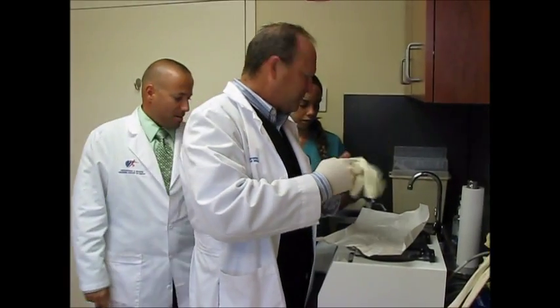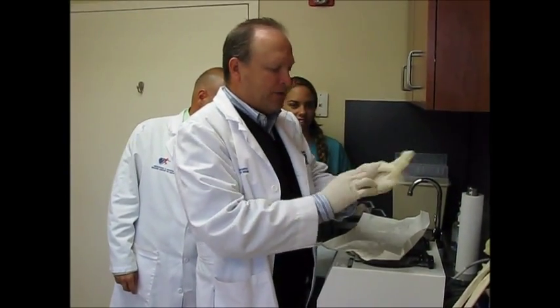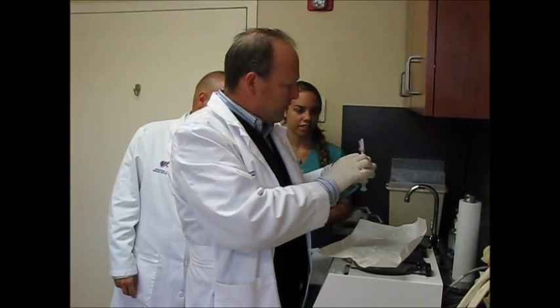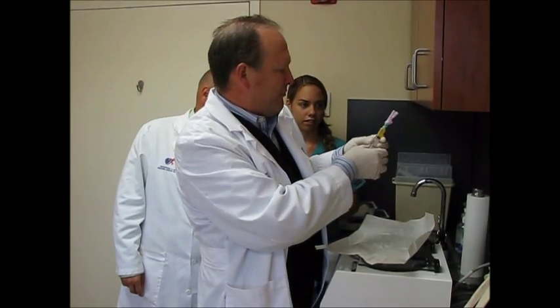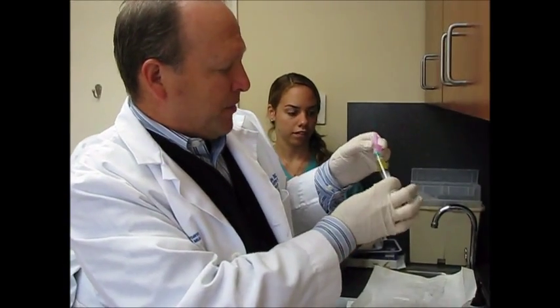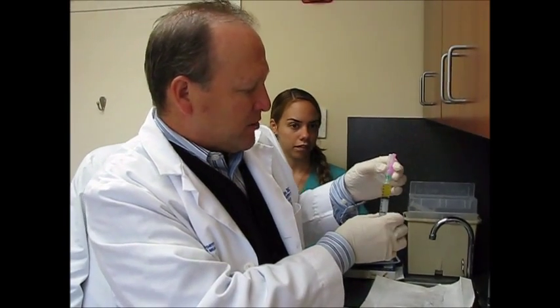We're doing this under sterile technique — sterile gloves, all sterile products. That's the plasma. We've got almost exactly five cc's of plasma. You can see it's yellow; it doesn't look anything like blood.